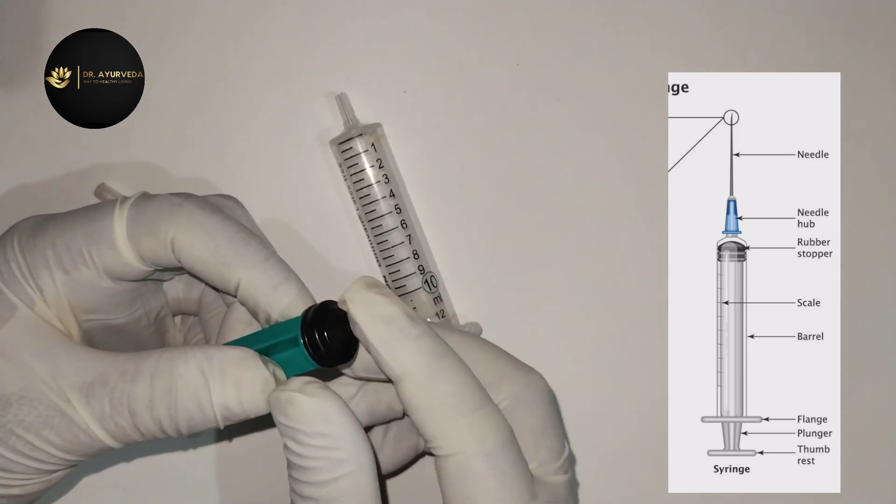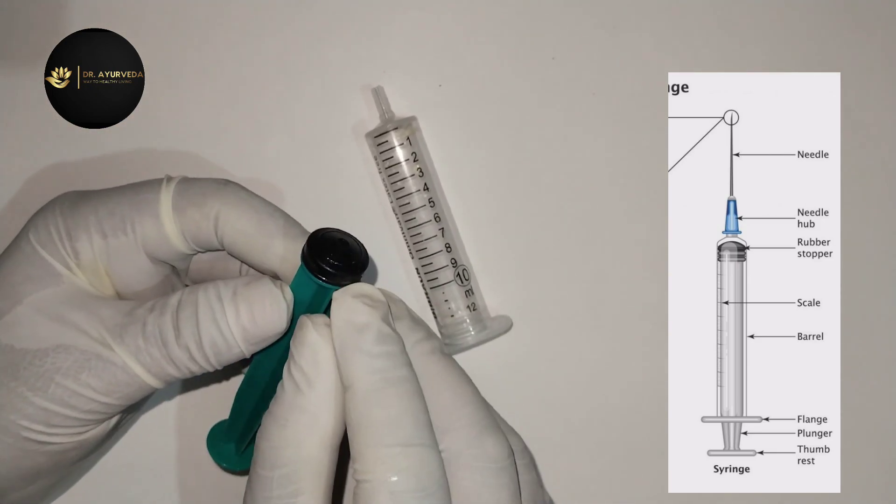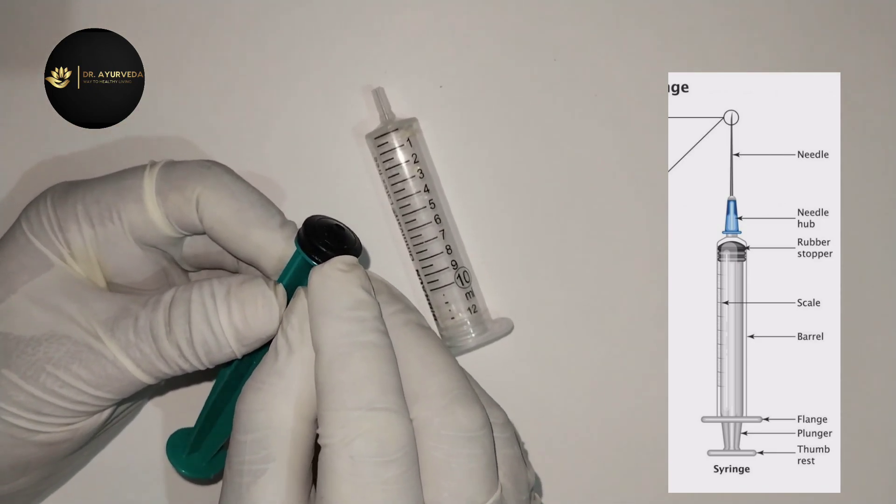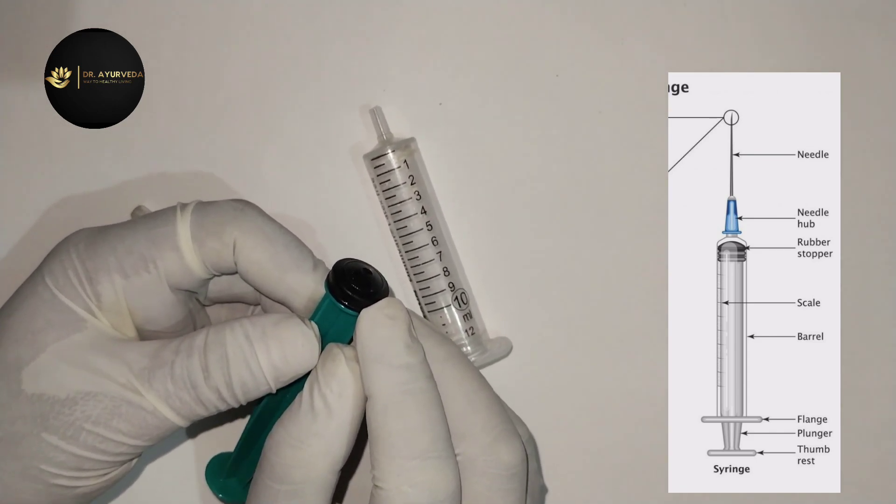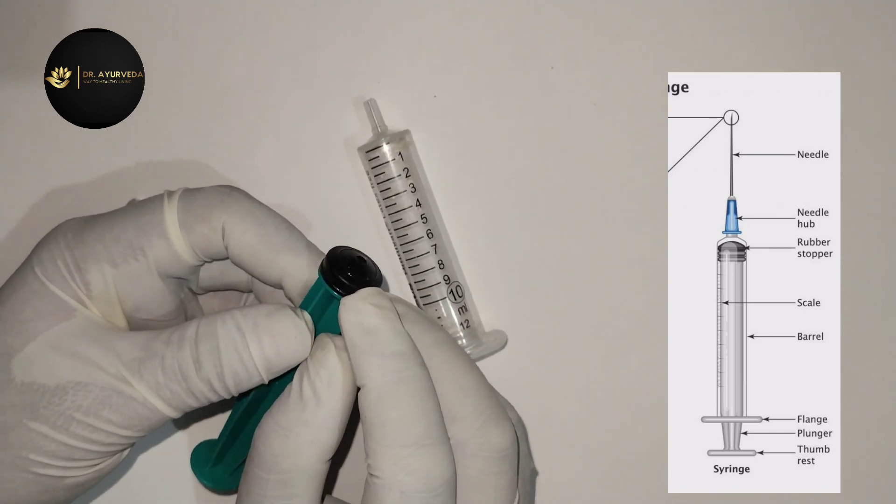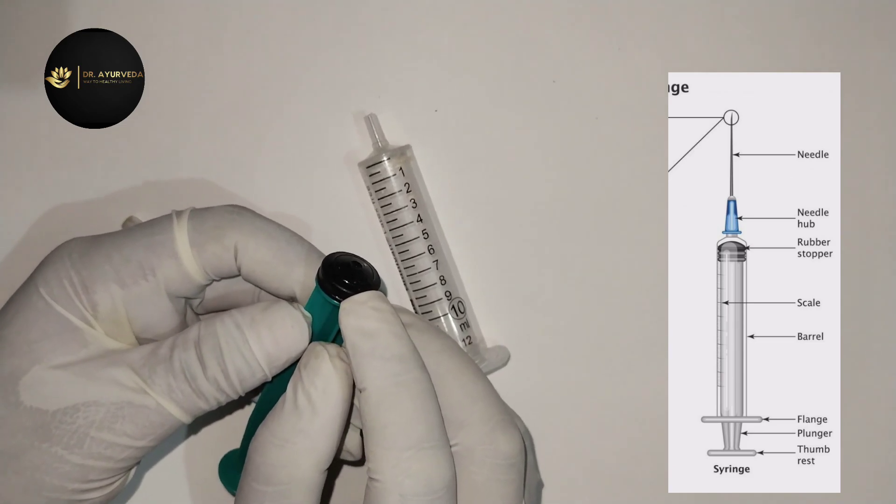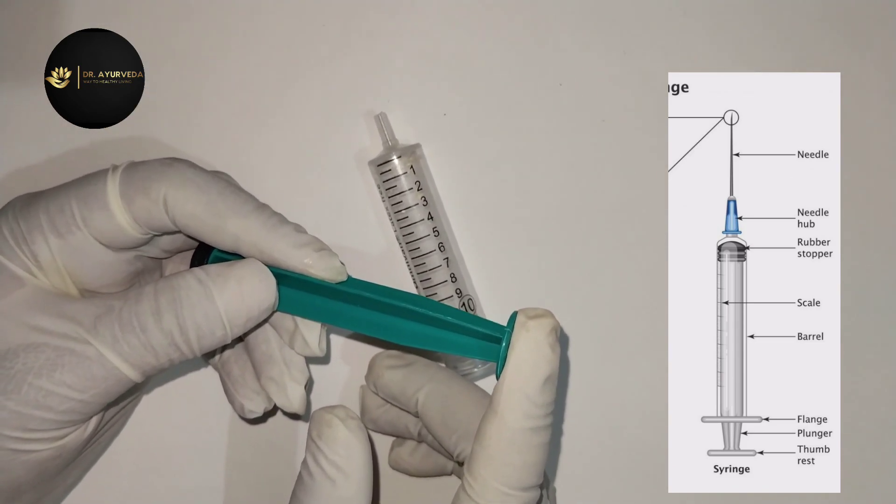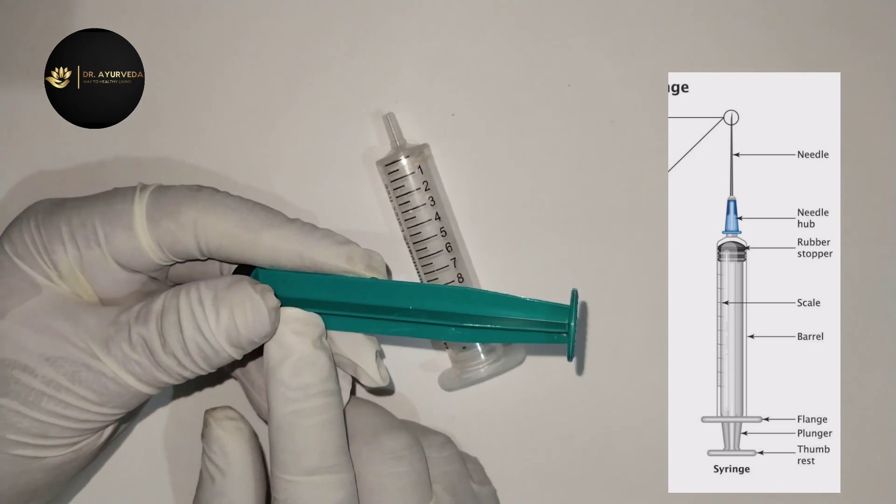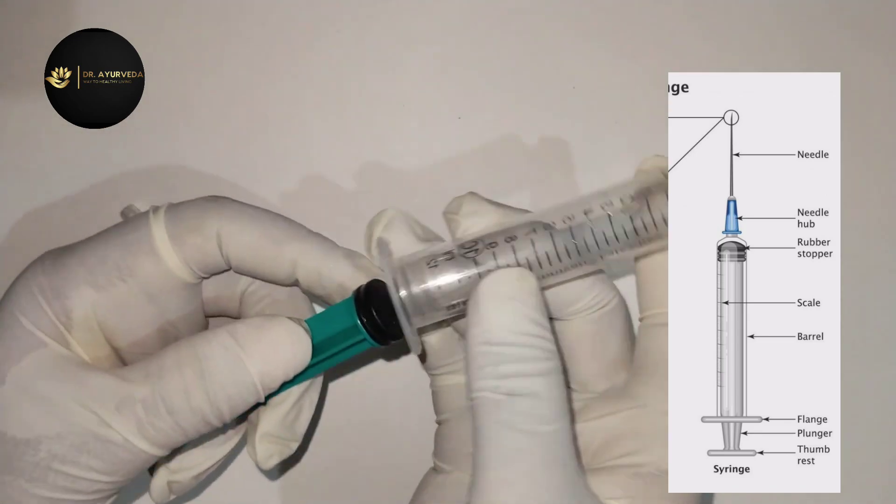First of all, the black area is called stopper. The upper line is called plunger. This area is called plunger.